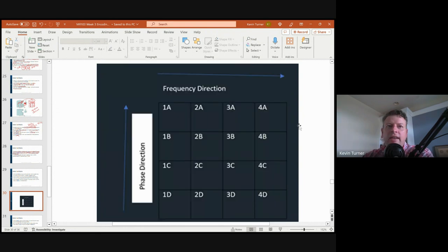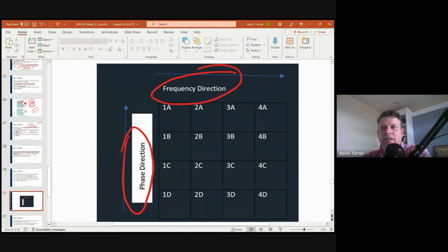So the idea here is that the phase encoding and the frequency encoding tell us exactly where the right numbers go. If the wrong information gets put in the wrong one, usually due to motion or wrap, then the image gets messed up. It doesn't look right. You get wrap, or you get motion artifact going across the image. Right. So if you mapped it out, it would look like a grid system with information in each space. Yeah, exactly. Exactly.